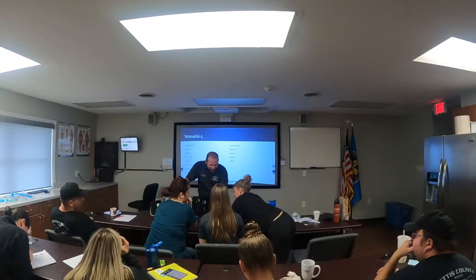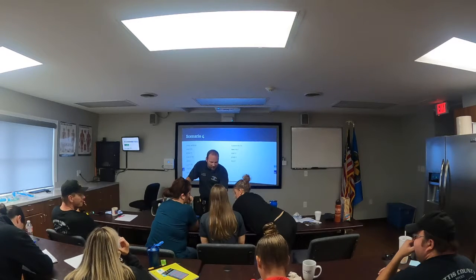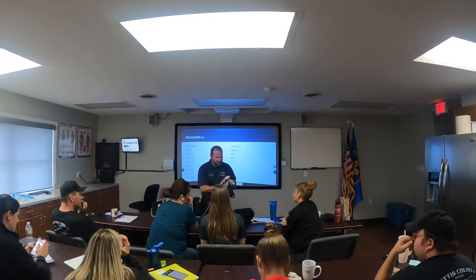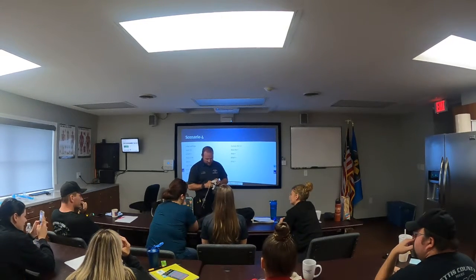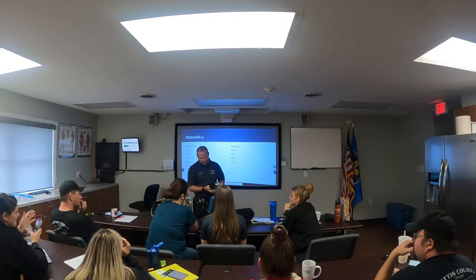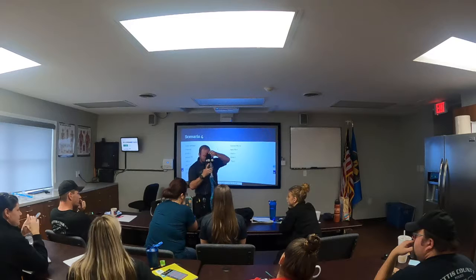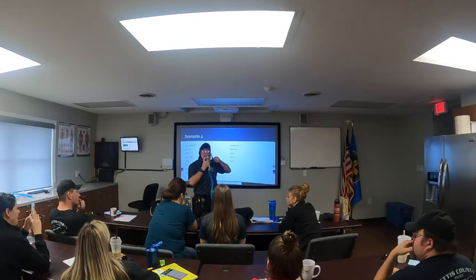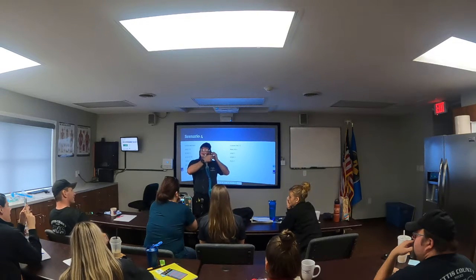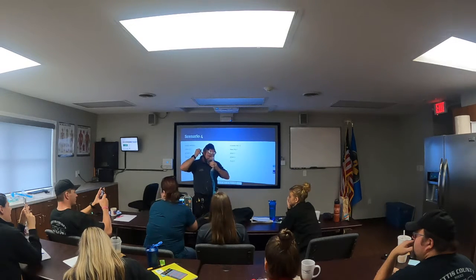So what do we currently have that's set? 10 on the flat. Okay, and currently right now we do not have the leak cuff added, so that's fine. Then when it comes with the mask, you want a good proper seal. This makes it more comfortable.